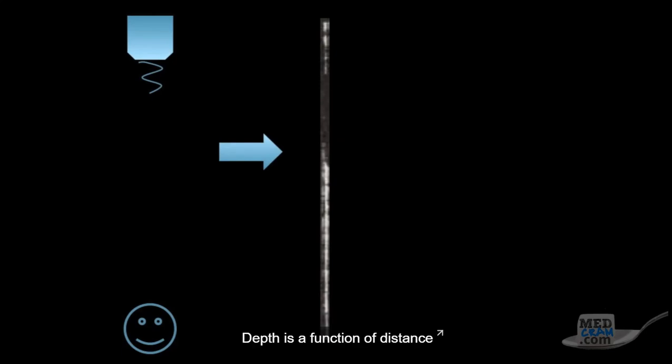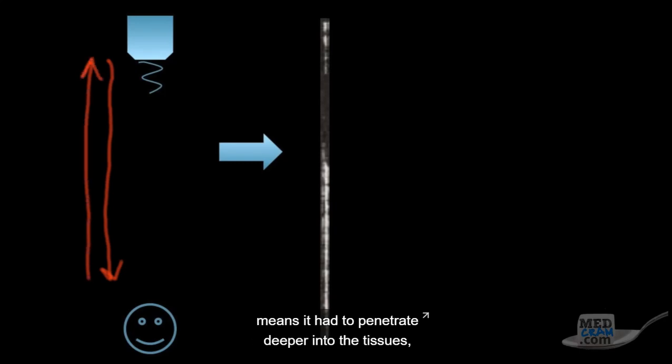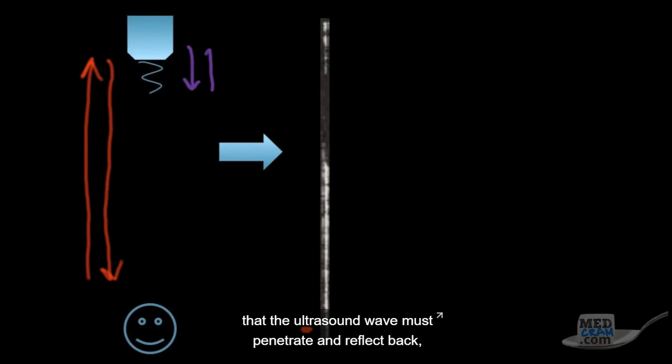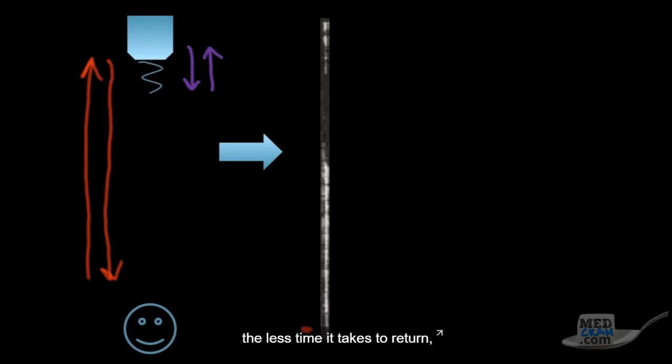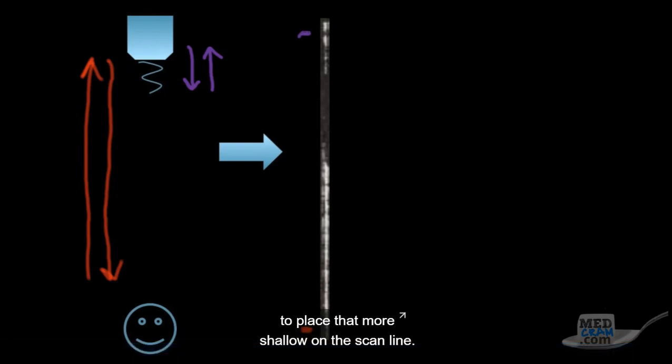Now, there's a few components of the scan line that I'd like to discuss, and one is depth. Depth is a function of distance to the ultrasound machine, meaning the longer that it takes to return to the ultrasound machine means it had to penetrate deeper into the tissues. And the ultrasound machine knows to place those returning echoes deep in the scan line. Conversely, the more shallow that the ultrasound wave must penetrate and reflect back, the less time it takes to return, and therefore the ultrasound machine knows to place that more shallow on the scan line.